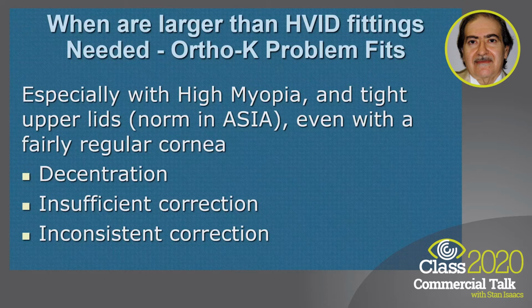Assuming you have a fairly basic Ortho-K patient with a fairly normal cornea, high myopia, the problem is with Asian eyes especially, you have very, very tight lids. And when you try and put too much suction on the lens to change the power too much, the lens tends to decenter. The other problem is also when they sleep, the upper eyelids tend to push the lens down. Both these things cause insufficient correction. You don't get your full correction, and inconsistent correction. So some days they see well, some days they don't.